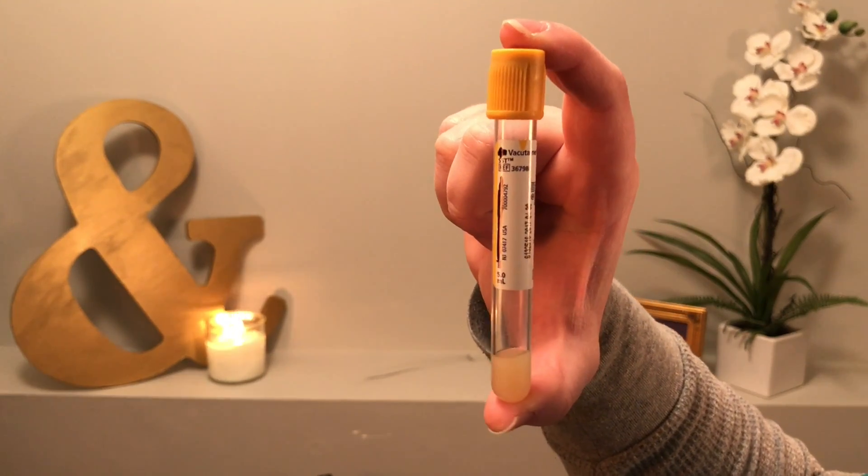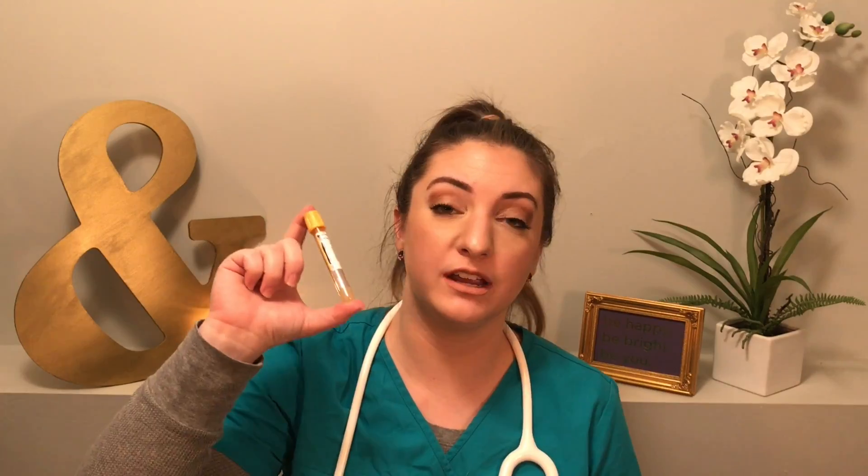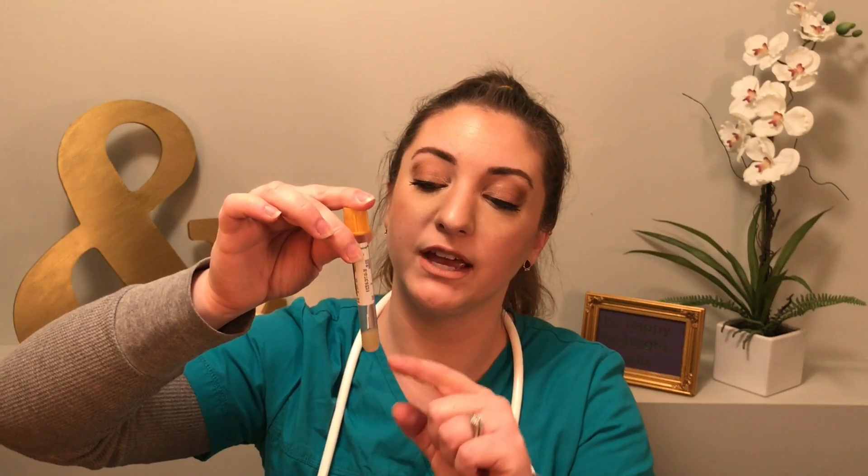The next one is the serum separator tube. The bottom has this little yellow gel — this is literally gold in a tube. This is like bread and butter to any clinic. The gel at the bottom is a clotting agent, so it helps the blood clot faster. Then we put it in the centrifuge. At the bottom you'll see a solid red area — all the solids from the blood. Then there's the gel layer. And on top, you'll see all of the liquid part of the blood, the serum. That is why they call it the serum separator tube.